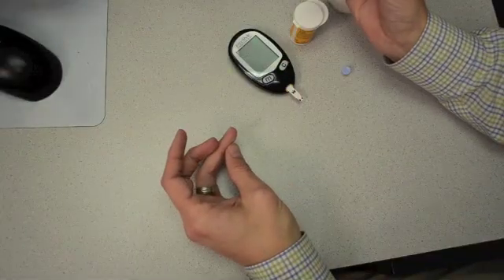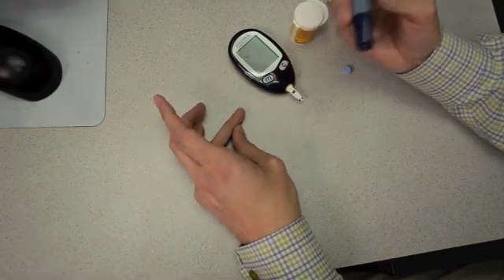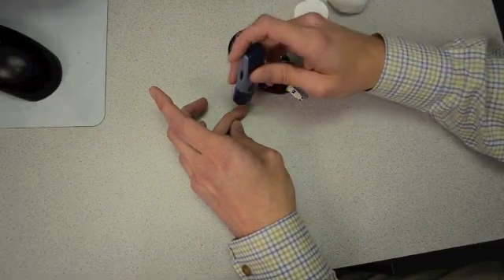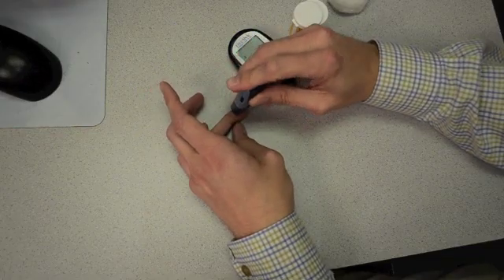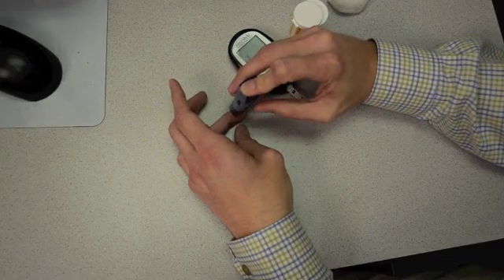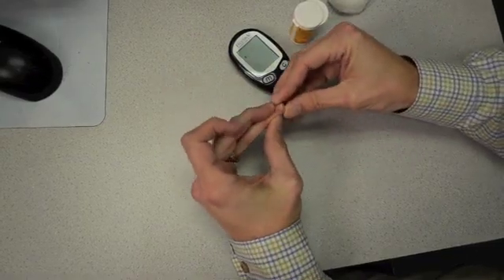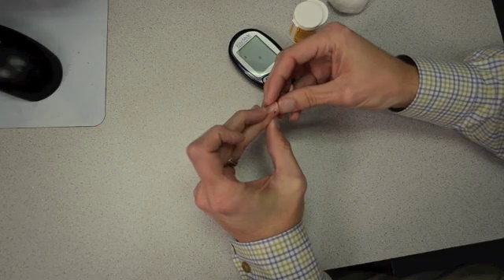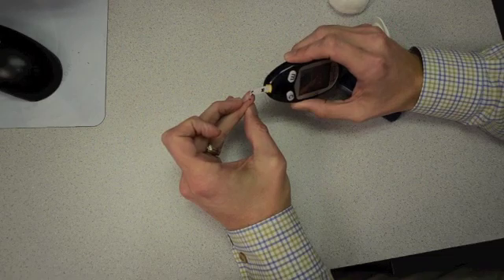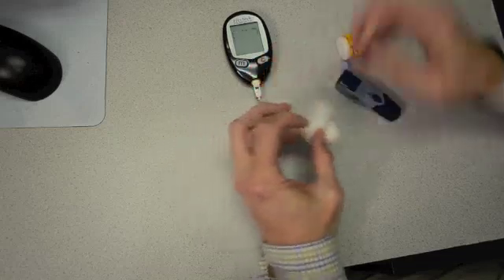After we get everything loaded, we're basically ready to do the stick. I recommend putting your finger on a hard surface like a table or file cabinet. A hard surface provides stability and allows you to apply adequate pressure to the sides of the fingers to get a good blood sample. Once you apply adequate pressure, all there is left to do is hit the button. It's as easy as that — we have a small drop of blood, which is really all it takes. Now bring the meter with the strip right over to it, suck the blood up into the meter, and in five seconds or less you'll have your reading.